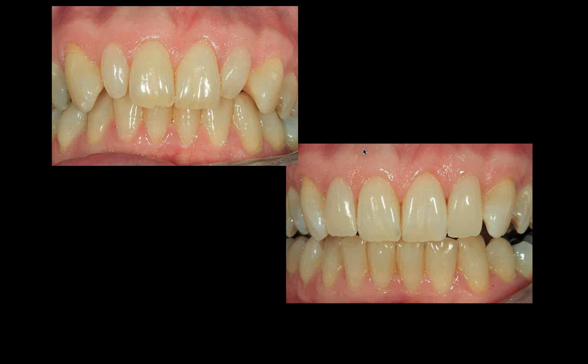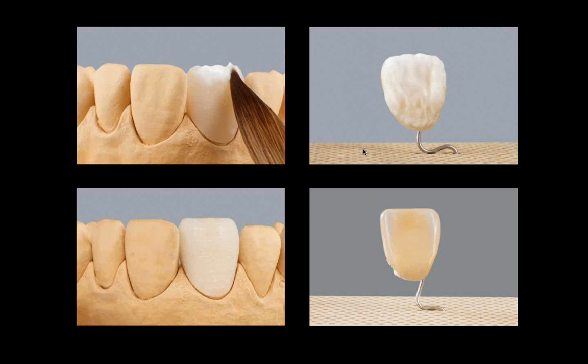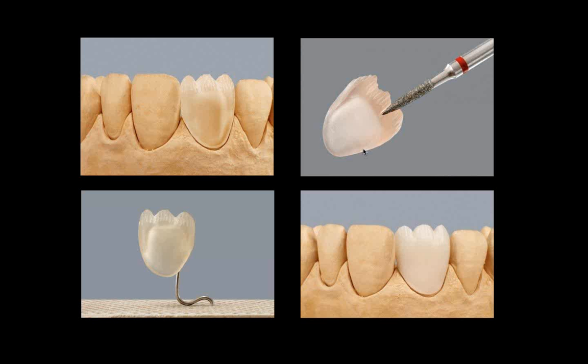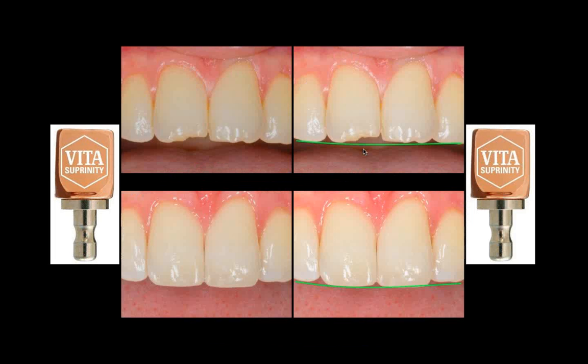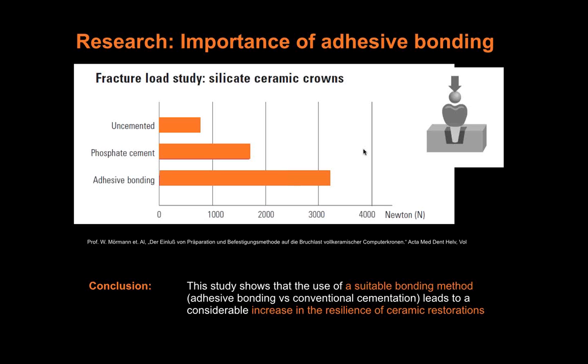Okay, and the product is put in the mouth and finished. So you see they look okay, they look nice. And again, not much effort has been taken to make these two veneers. And that's what we're looking for, this type of material. Most of the blocks which I use is the HT, the high translucent blocks, because they have a better chameleon effect. You can actually do veneers, you can do crowns, you can do whatever you want with this type of material.